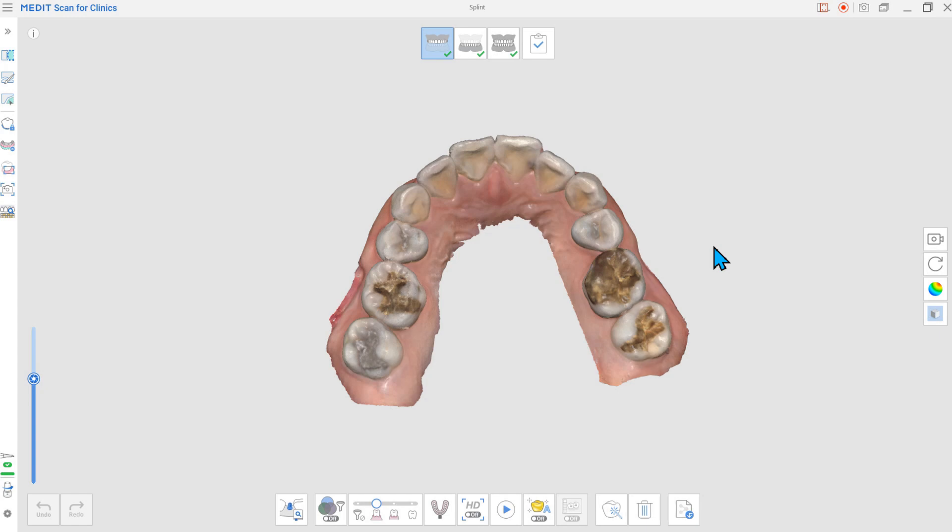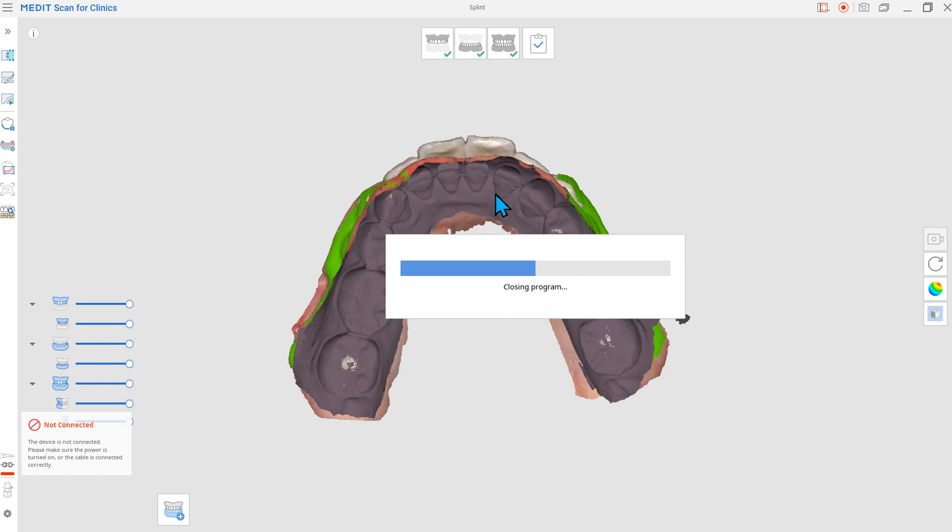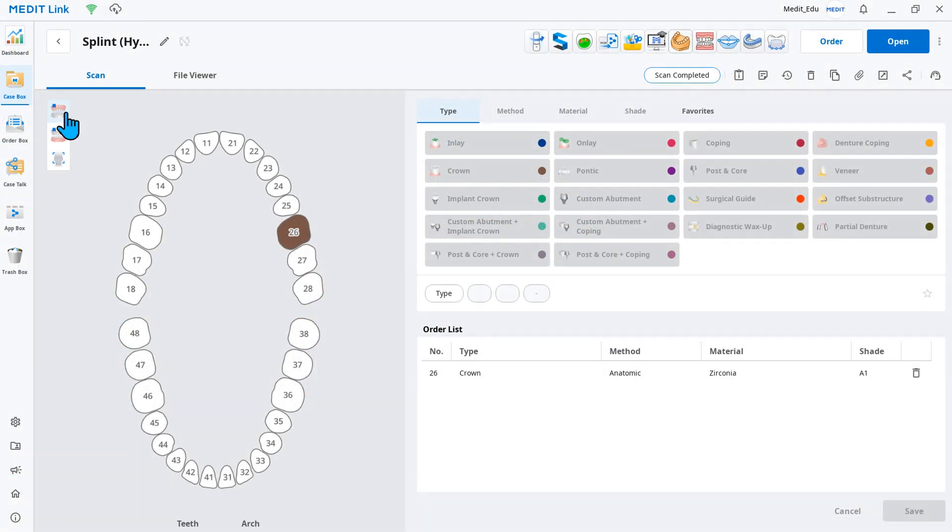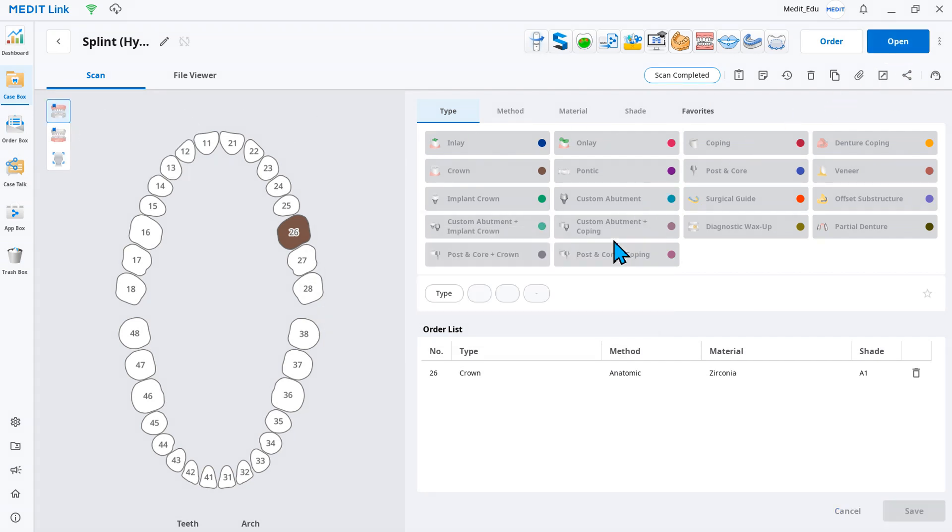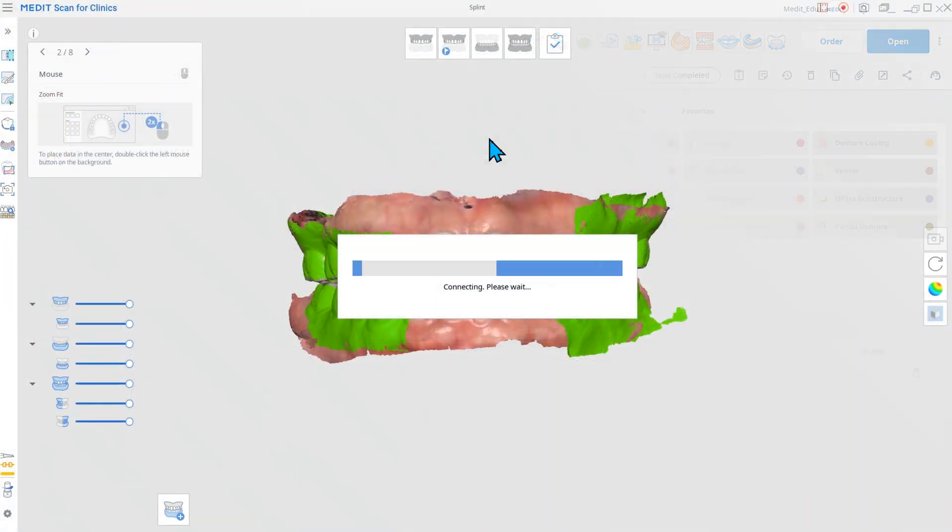Previously, you had to return to MeditLink to change what scan stages were included in your Medit Scan for Clinics workflow. Changing form information in MeditLink was the only way to add or remove scan stages if the form was initially left empty or if you modified the treatment plan during scanning.